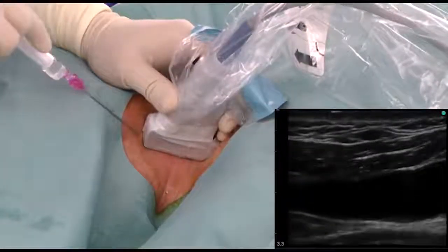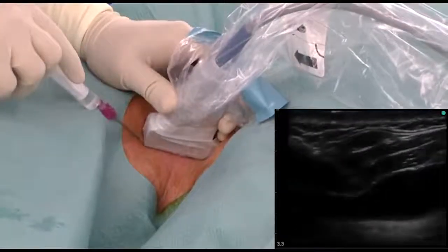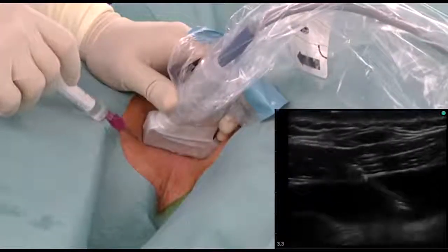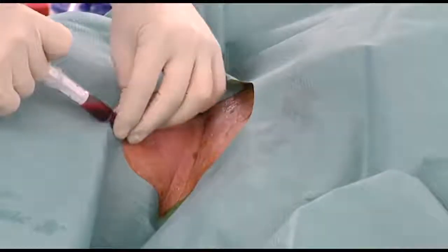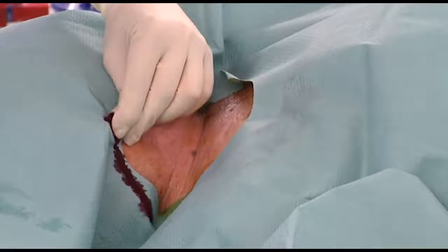The Seldinger needle is inserted in-plane to observe the entire length of the needle. After verifying the intravascular location of the needle tip, proceed to aspirate with the syringe and confirm that venous blood reflux is observed. The transducer is then removed and the guide wire introduced through the needle.